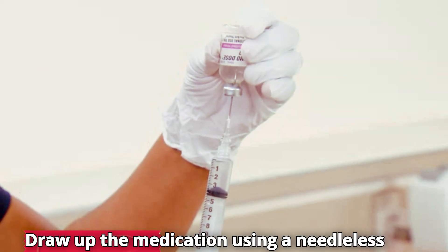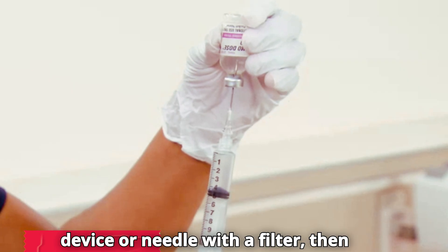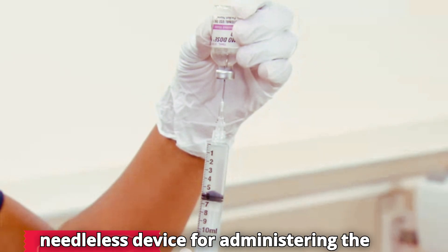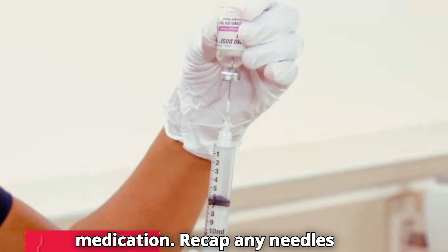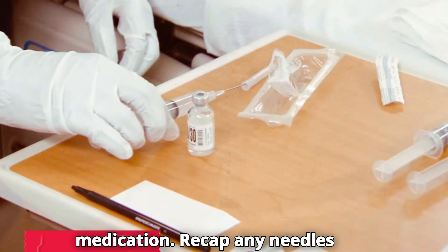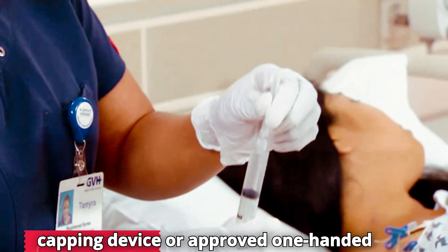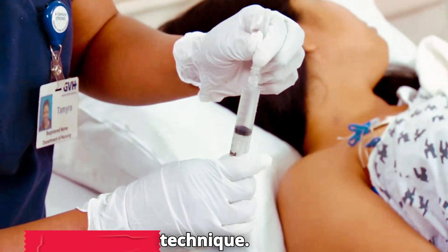Draw up the medication using a needleless device or needle with a filter. Then change to a sterile safety needle or needleless device for administering the medication. Recap any needles throughout as needed using a needle capping device or approved one-handed technique.